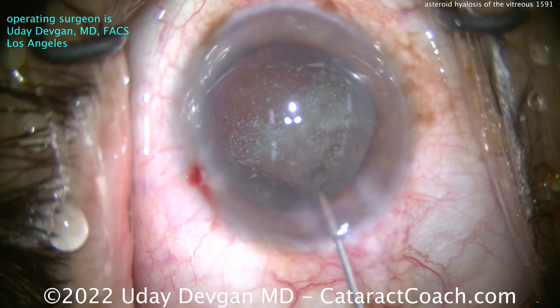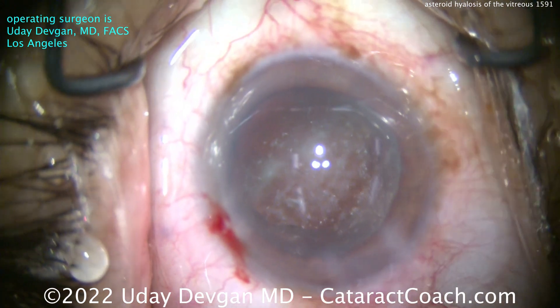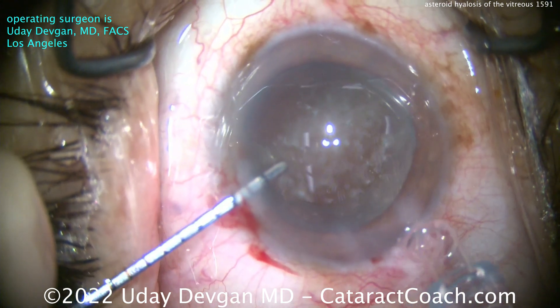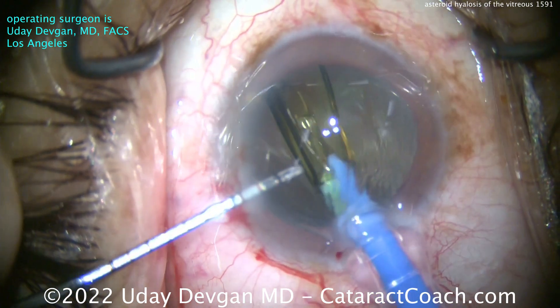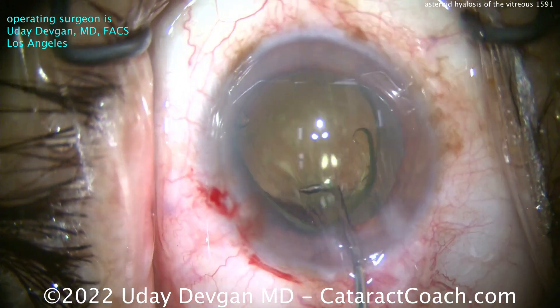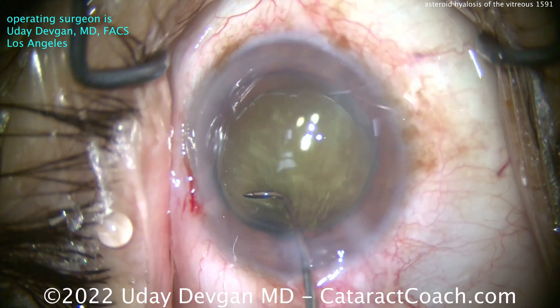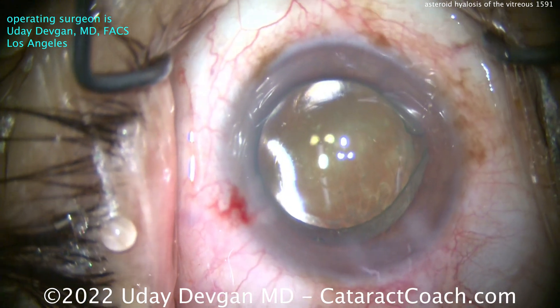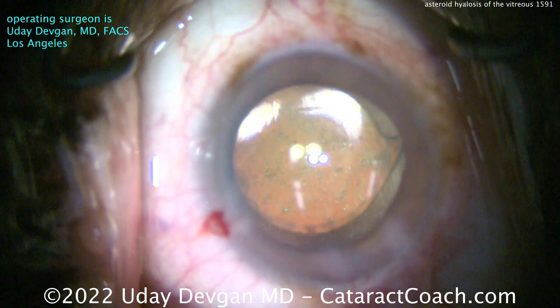Now look what happens — I'll put the cohesive viscoelastic in to fill the capsular bag and you can push back that vitreous. This is also the reason why if you get a rupture of the posterior capsule and prolapse of vitreous, it's so difficult to keep removing that vitreous — it's so liquid, it just tends to want to prolapse. We'll get the IOL in and plant it in the capsular bag. Should you use a yellow-tinted lens or a lens with no tint? I'm not so sure that plays an important role in this case of asteroid hyalosis. You may also want to be cautious about using a hydrophilic acrylic lens — this is a hydrophobic acrylic lens. There have been case reports of hydrophilic IOLs having issues with the lens itself being opacified or calcified, and this may play a role in that.